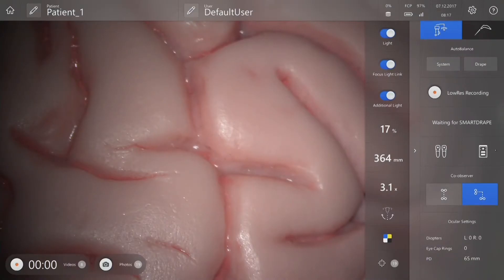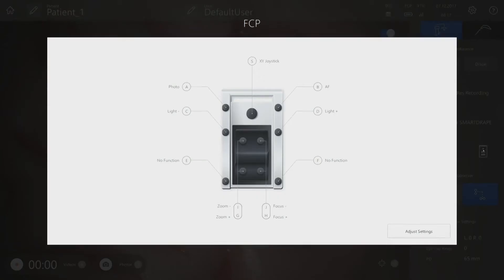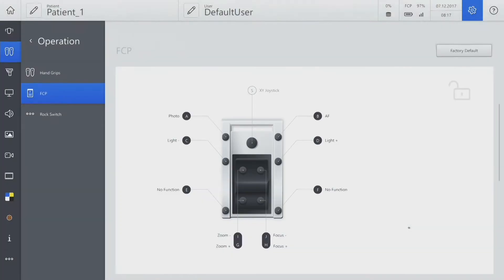To configure the foot control panel, go to the icon on the main screen and go to Adjust settings. Configure the top button on the right for Zeiss Kivo.